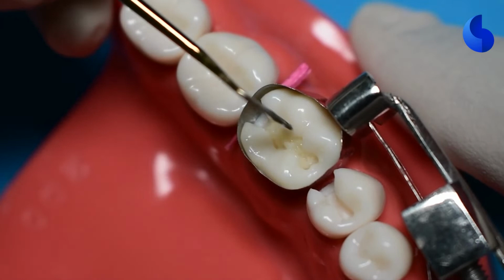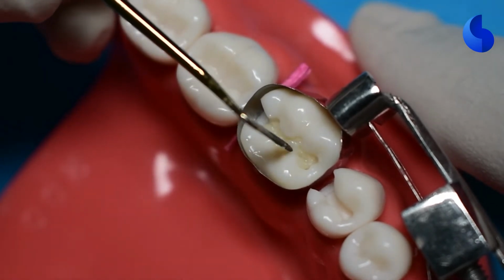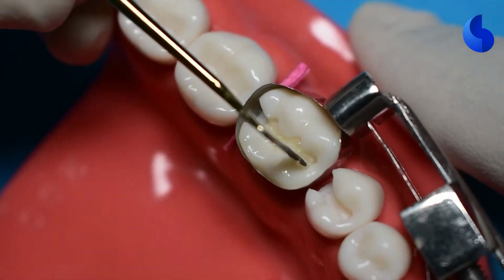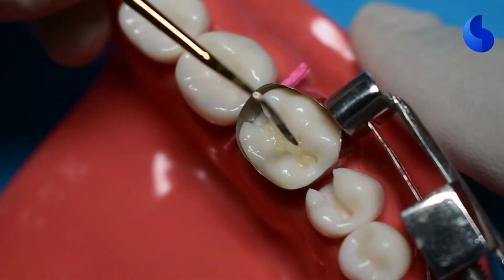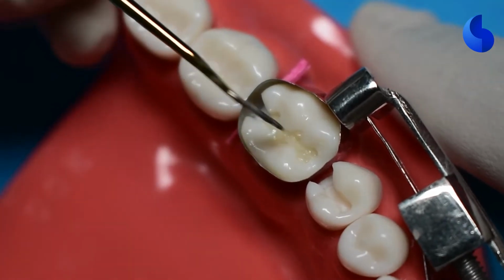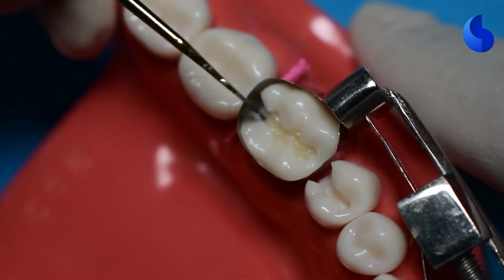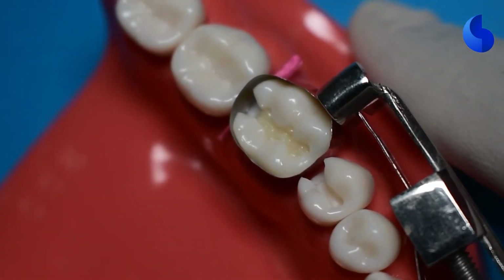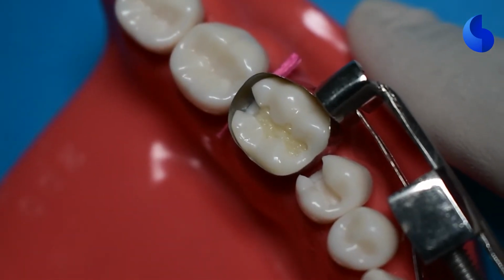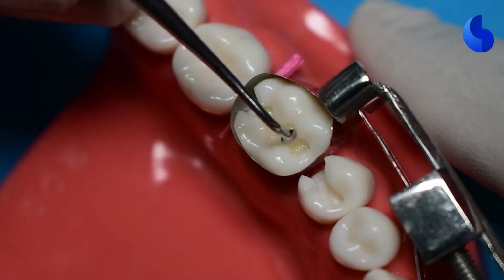In another video of ours, we'll show you a different technique where we'll be condensing composite on the proximal box area first, basically making this class 2 cavity into a class 1 cavity and then treating it like a class 1 cavity after removing our Tofflemire band. That's a different video altogether where we restore it on a premolar. In this video, we'll be restoring the occlusal part of the cavity first.